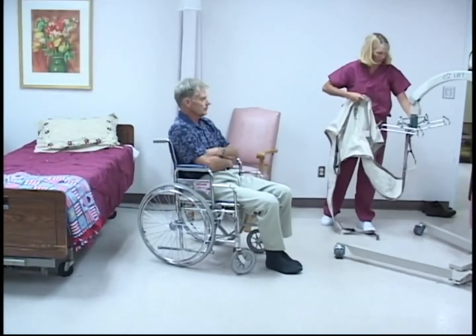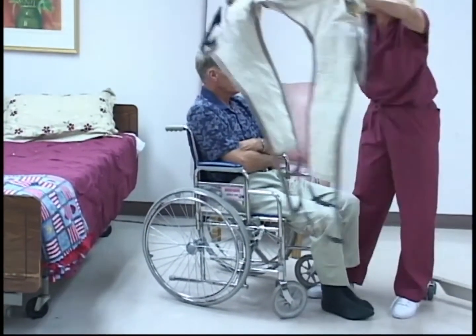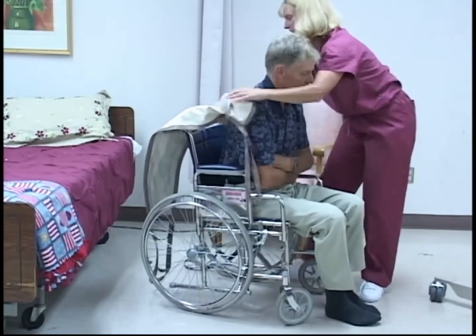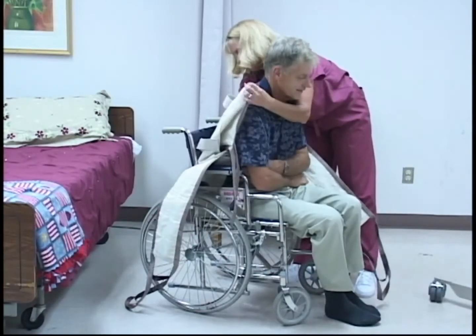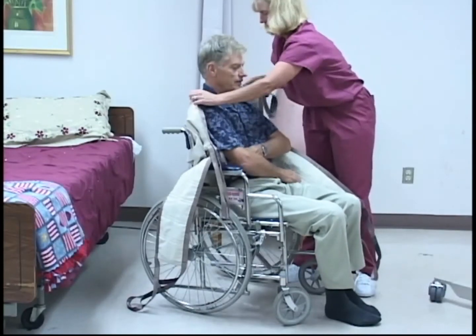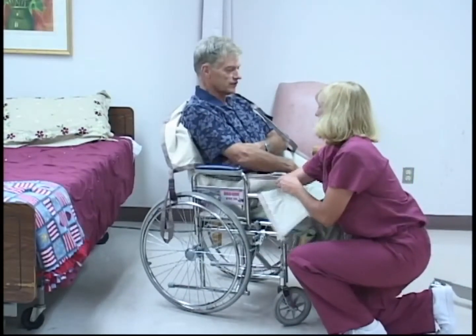When standing in front of the patient, lean them forward several inches to facilitate the positioning of the sling behind the patient. With the sling handles and EZ-Way logo toward the chair back, place the sling behind the patient, keeping the center handle of the sling centered on the patient's spine. Make sure the opening of the sling touches the patient's tailbone.